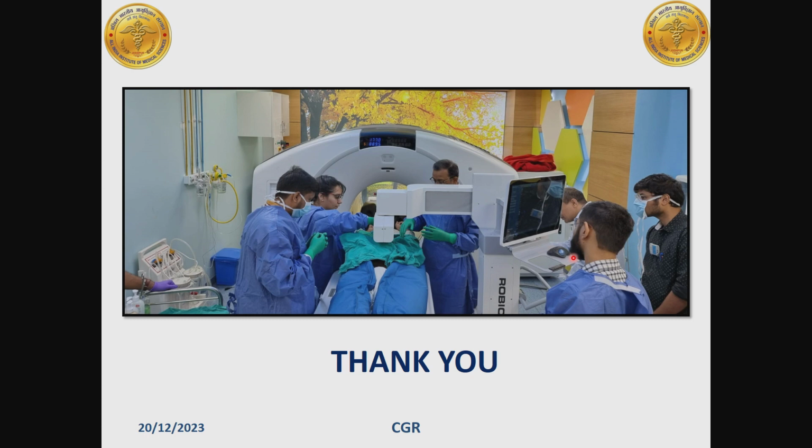Moreover, what I talked about is real time. There are times when the PET images are also taken into consideration, even in liver biopsies or other site biopsies. It is seen which area has a high uptake, and then we guide the biopsy needle on anatomical modalities also. So that is also one utilization of PET guided biopsy, though it is not real time. So if we are utilizing metabolic biopsies, then why not do a real time one, where the precision is much better than by hand?